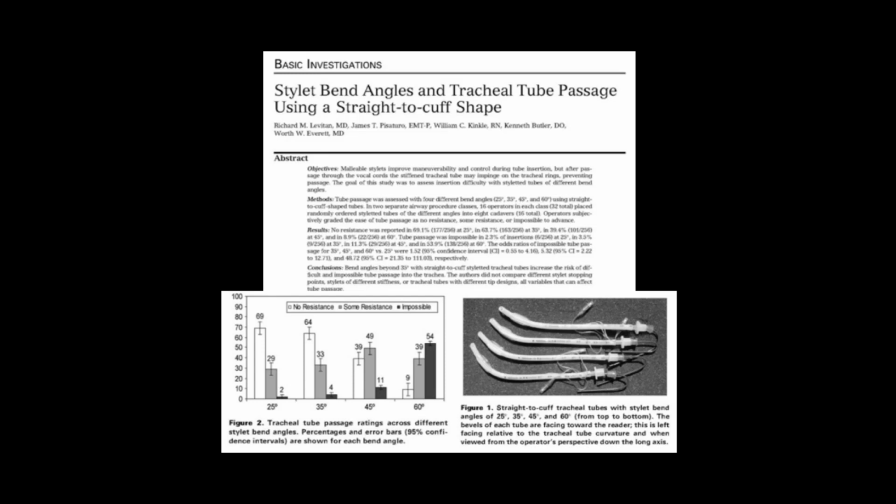Another issue in terms of placement with proof is the shape of an endotracheal tube. We want you to shape your endotracheal tube to the way that you are most comfortable with in using a stylet. Often the respiratory therapist in assistance in preparing your equipment will place particular curves or shapes in your endotracheal tube. We want you to use whatever curve you're most familiar with and comfortable with.